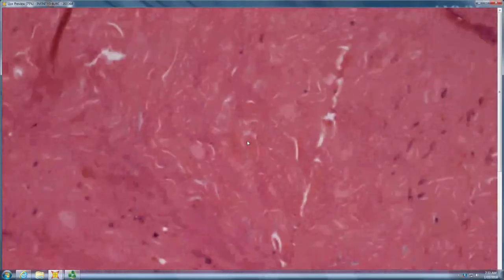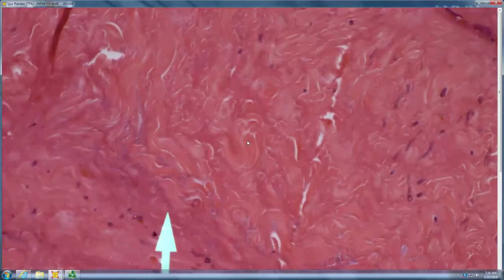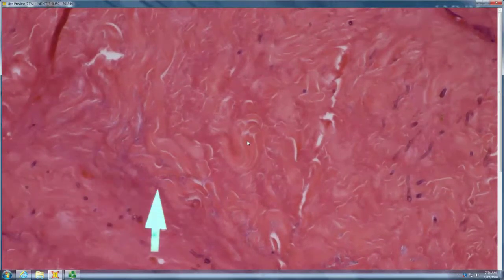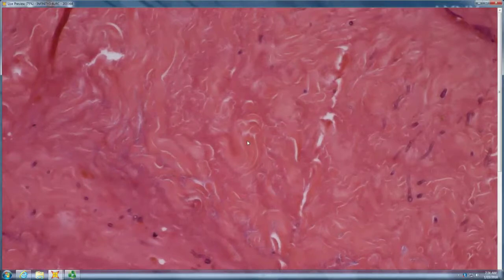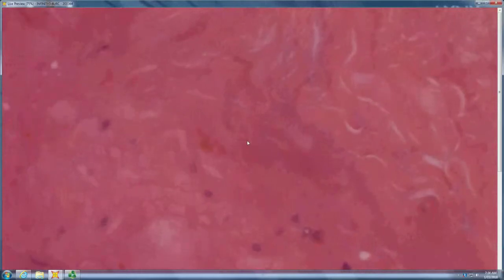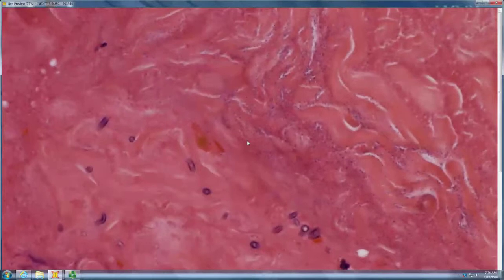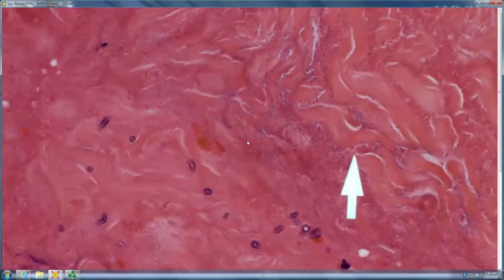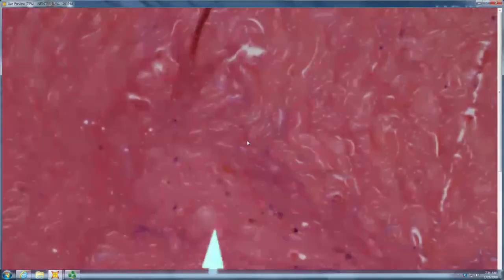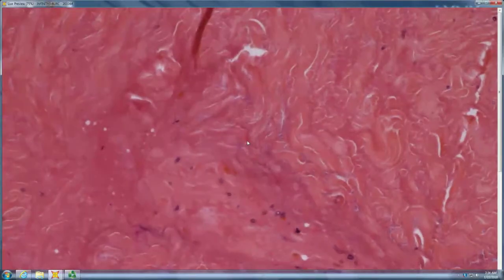The other thing in the background, see all that basophilic stuff? So you got a dead vessel with no neutrophils in sight and that stuff. So what else do you have? Yeah, exactly. So ecthyma gangrenosum. So I think you can make them out reasonably well there. So that is ecthyma gangrenosum concurrent with fungal. So you have fungal and Pseudomonas sepsis concurrence.